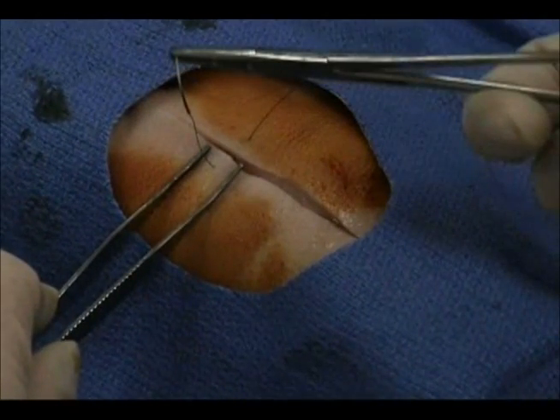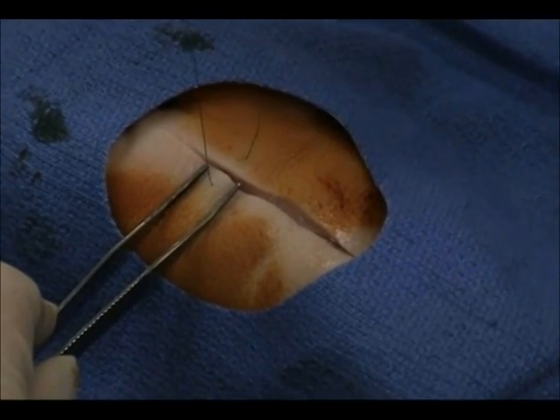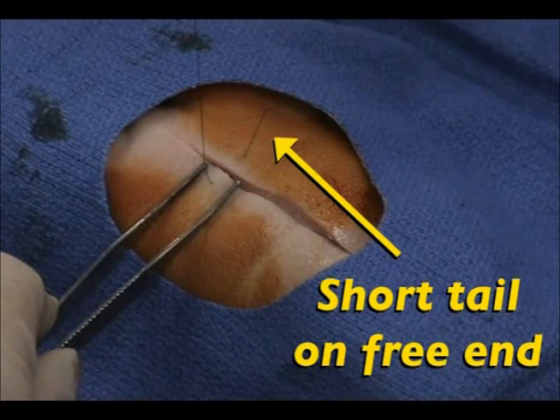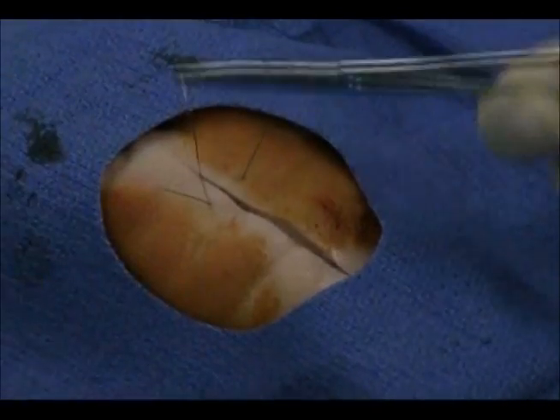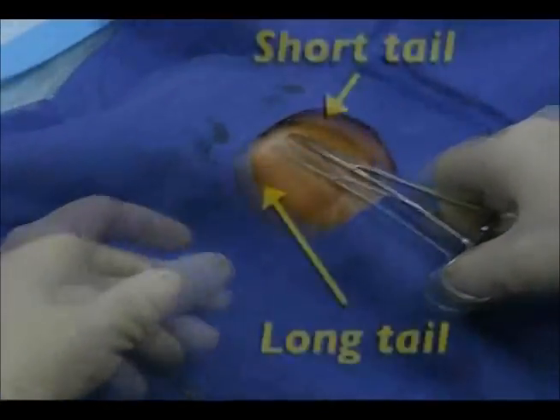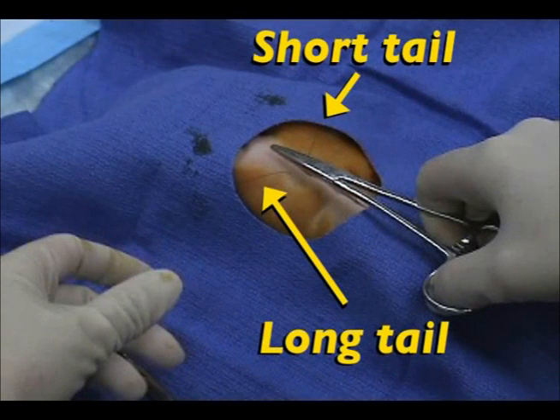Securing the suture is done in multiple layer knots to prevent accidental untying of the knot. First, leave a short suture tail on the free end of the suture. Next, release the needle from the needle driver and rest it in a secure place to reduce the risk of a needle stick injury. Now, position the needle driver directly over and parallel to the wound. There should be a suture tail on either side of the needle driver.